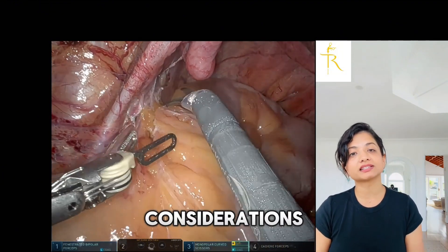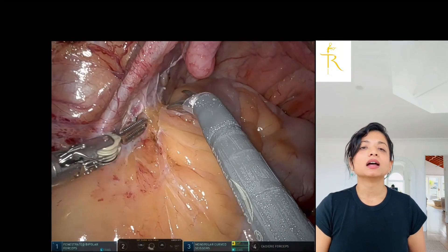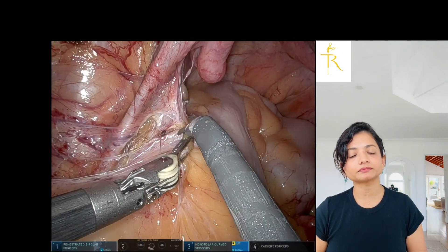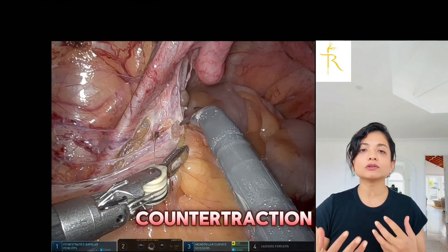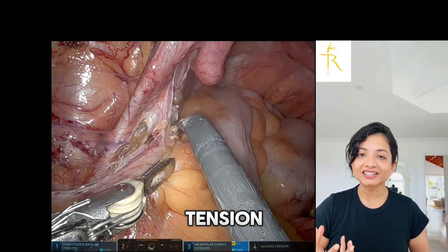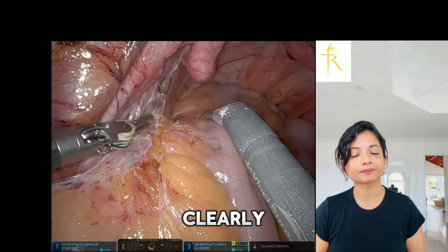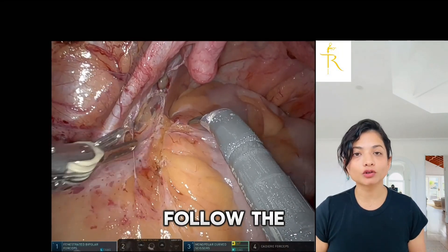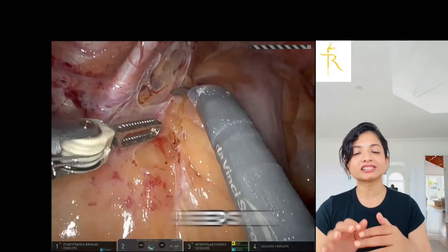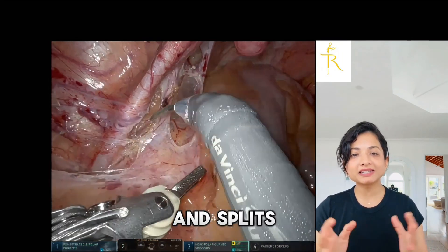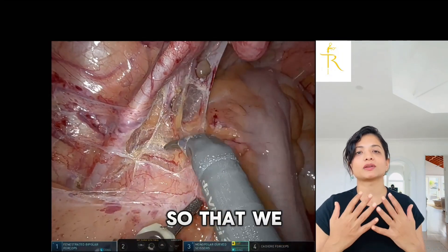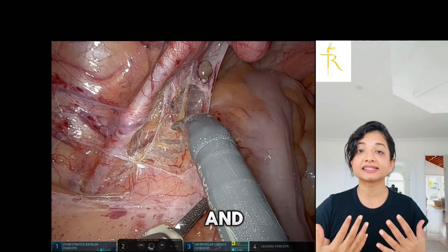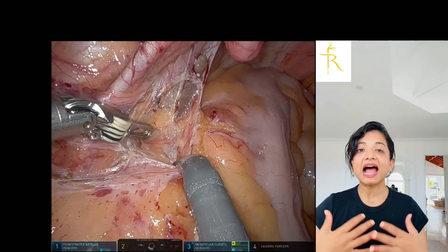There are a few important considerations here: to stay in the correct plane to minimize bleeding, we use counter-traction to create tension and define the tissue planes more clearly. When we do this, all we have to do is follow the bubbles where the pneumo seeps in and splits the areolar tissue, so that we have a clear understanding of the anatomy.